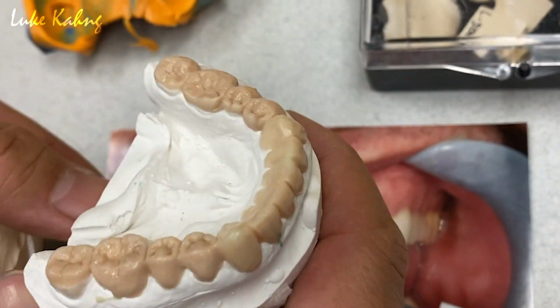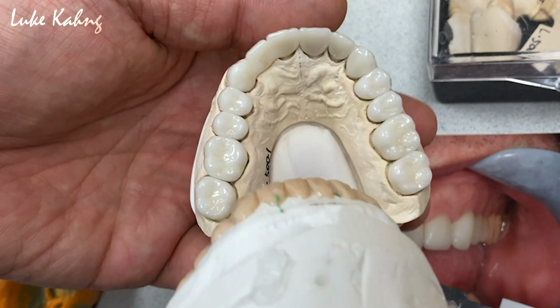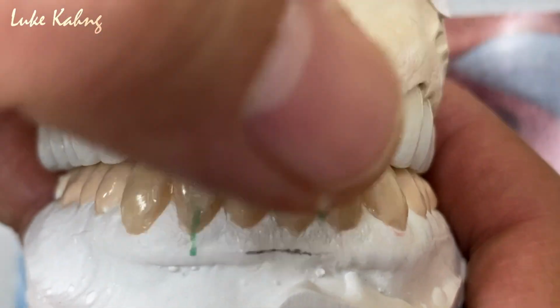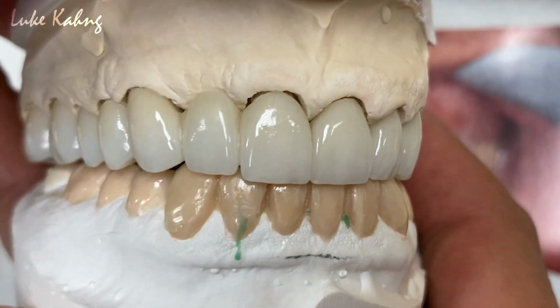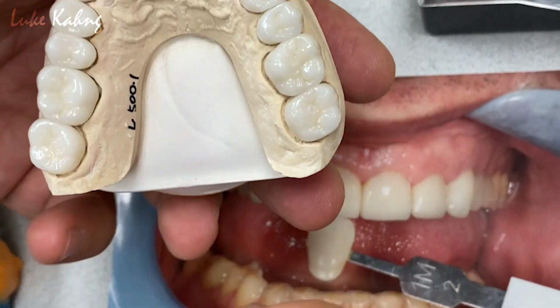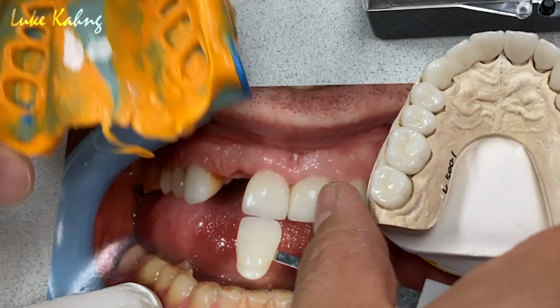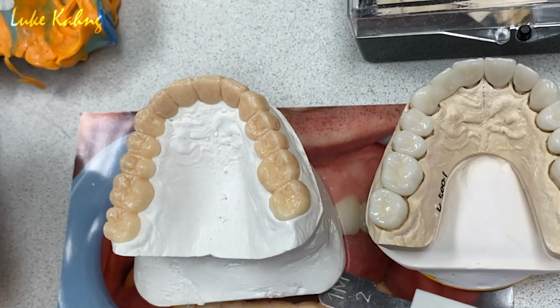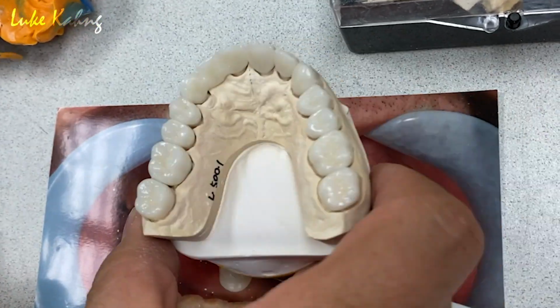So we are ready for this. Okay, so this is the full design. That's why we fabricated a 28-unit teeth design, so that we can predict his lower height of contour. So I'd like to show you guys the impression and the wax up.